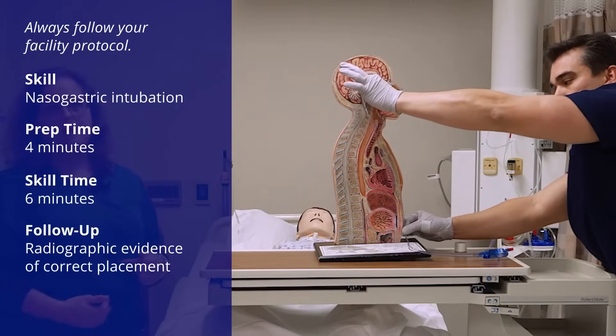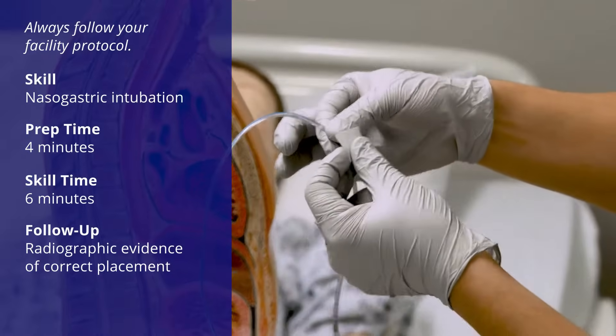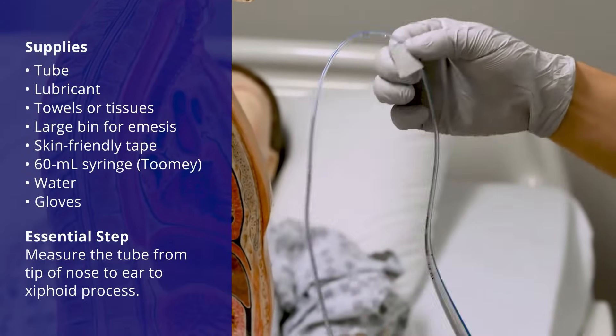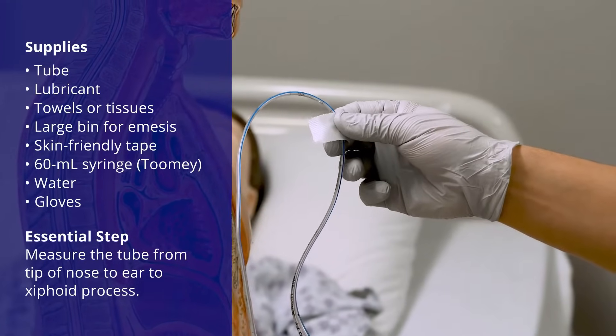Now that's going to be his mark. What I suggest you do is put a little piece of tape there so that you can remember what your mark was, because otherwise the patient might get a little wily and you might not remember what the actual number was.